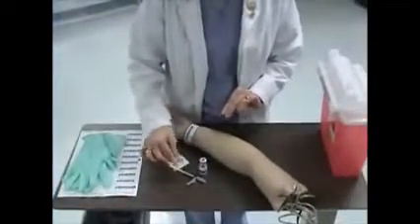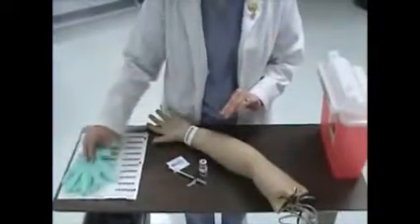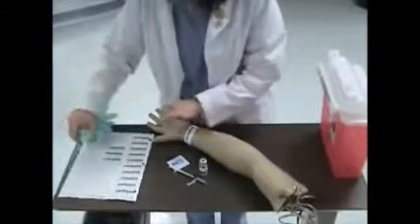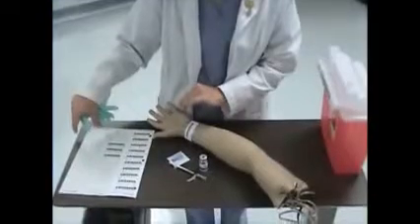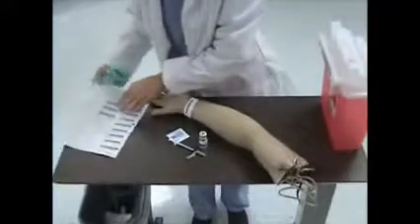At this point, I will place a label on the syringe that will identify the medication. On the label, I need to include the medication, the dose, and the route.